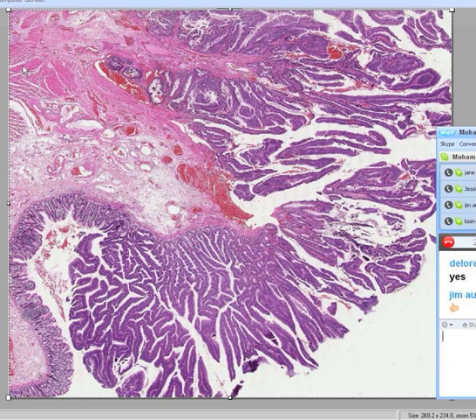But as you might guess, it's not the submucosa or the smooth muscle that we want to show you on this case. It is actually the mucosa, because what you have here is normal mucosa, normal mucosa, normal mucosa. I'm traveling north in California, and now I'm coming up and normal mucosa.